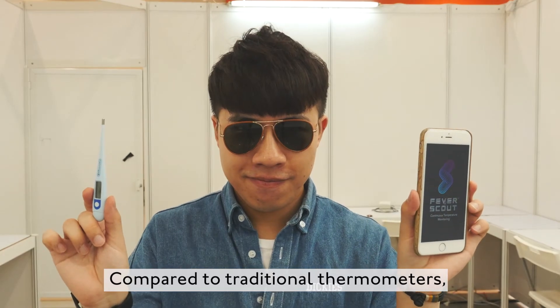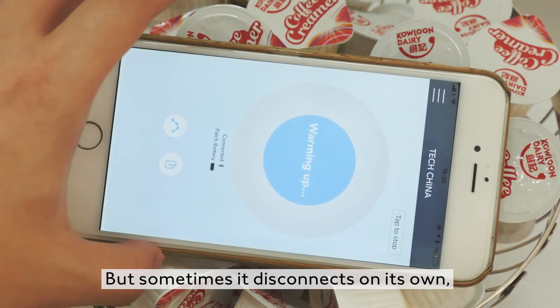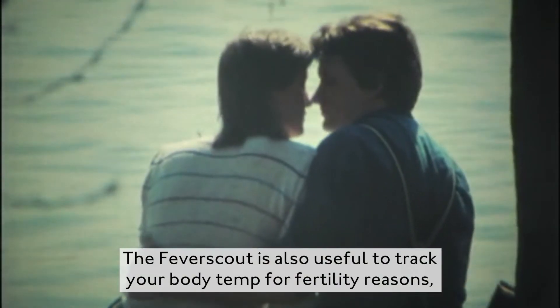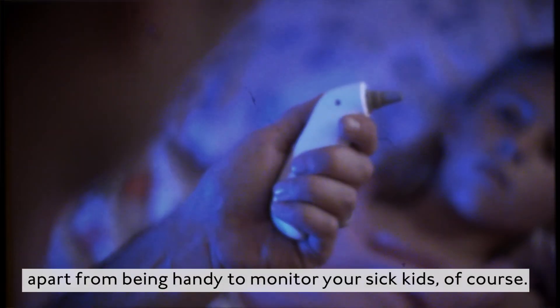Compared to traditional thermometers, the difference is more or less 1 degree Celsius. It sometimes disconnects on its own and severely drains my phone's battery. The Fever Scout is also useful for tracking your body temperature for fertility reasons, apart from being handy to monitor your sick kids.